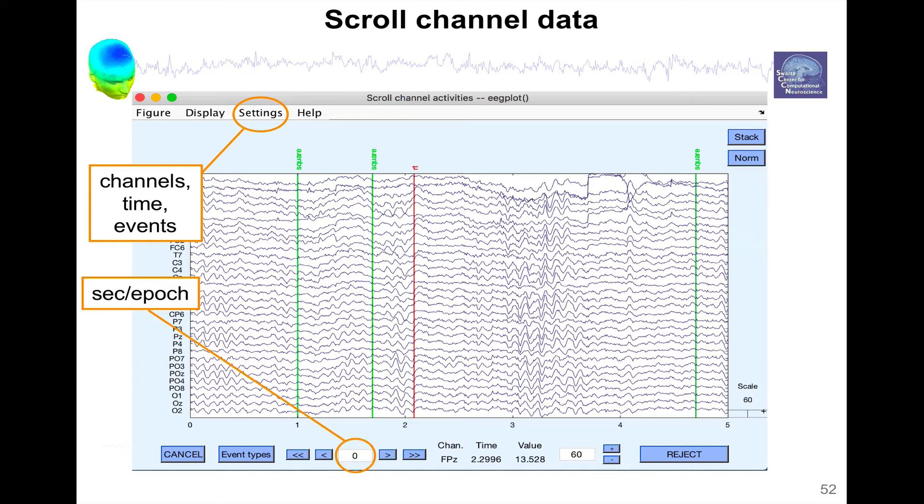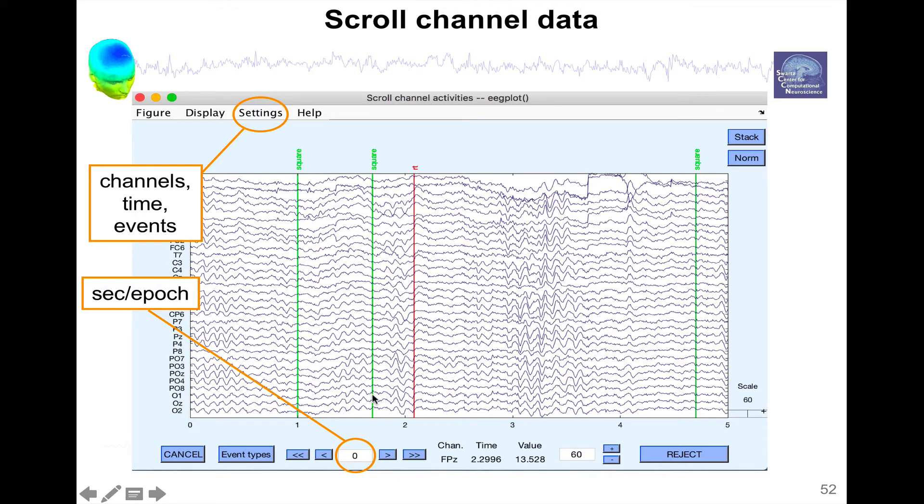You have this edit box here where you can see where is the beginning of the data pointing to, so here it's time zero is at the beginning. It can also be when you're visualizing data epochs, this will be the first epoch, what is the first epoch that's being seen.